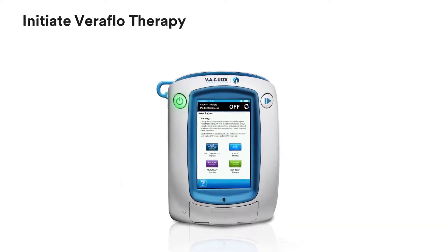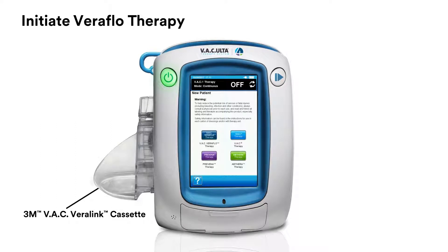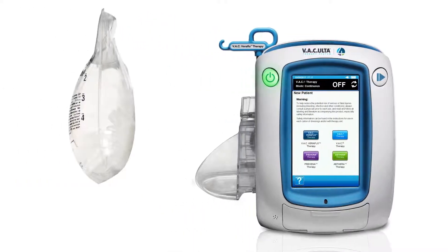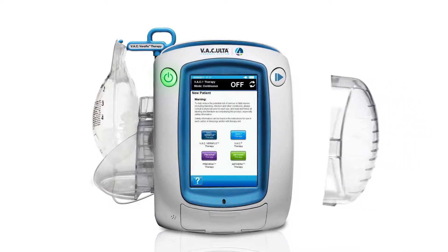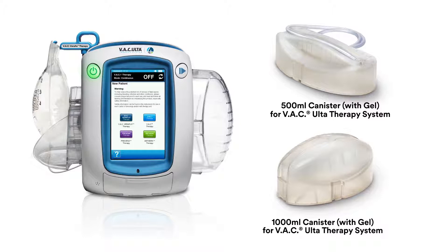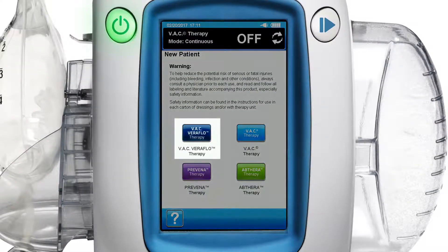To initiate Veriflow therapy, attach the 3M VAC Verilink cassette for convenient solution storage and delivery. Raise the solution container hanger arm, rotate it 180 degrees and lock into place. Spike the solution container, rotate the spike a quarter turn and position it in the VAC Verilink cassette. Attach the 500ml or 1000ml canister to the VAC Alta4 therapy unit. Press the dark blue VAC Veriflow therapy button.